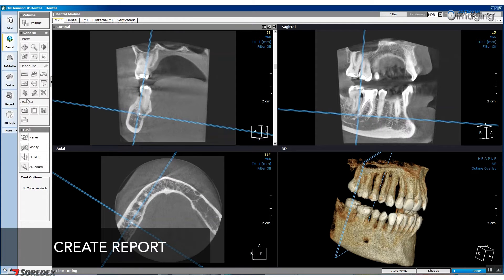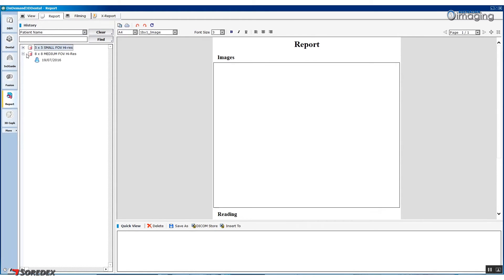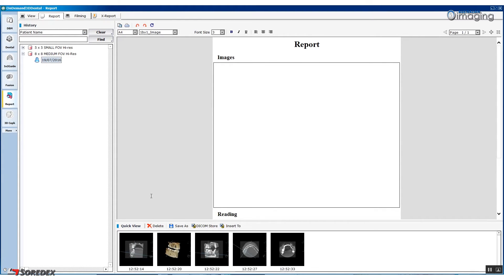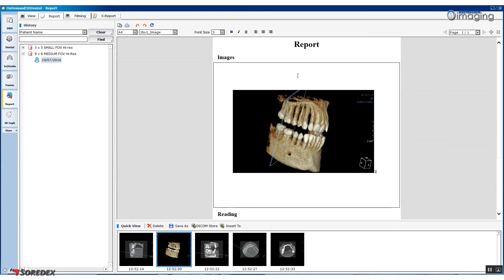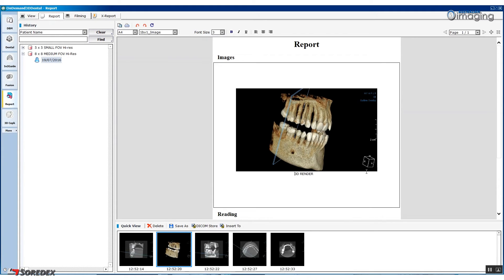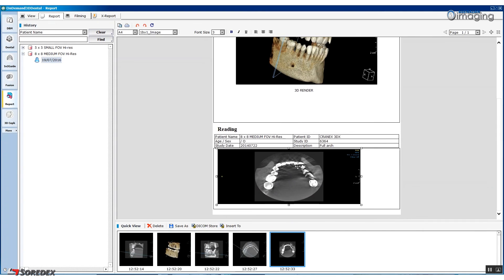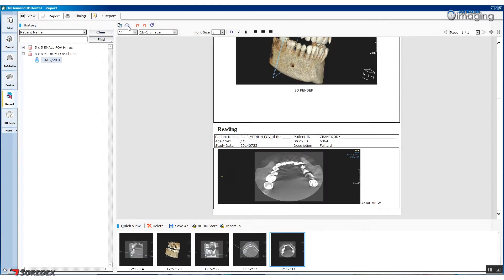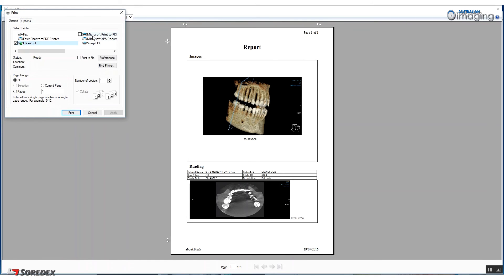To create a report, click the Report icon in the left navigation pane and then select the project you are working on. Using the capture functionality, click on the images you wish to use in your report. Next, go into Report mode. We are able to drag and drop images into the report and make relevant notes. To export and save, press the print icon and save the PDF to your desired location.